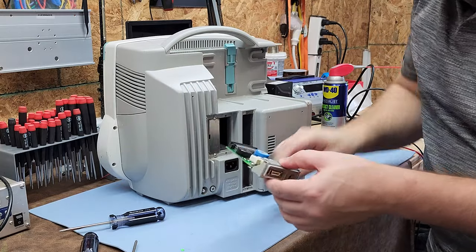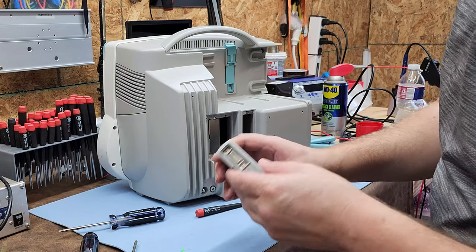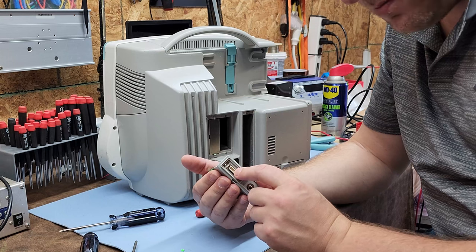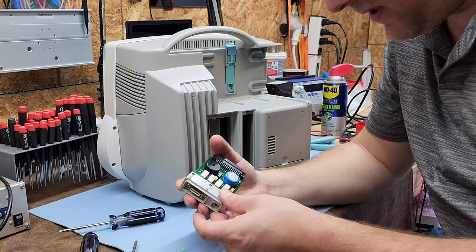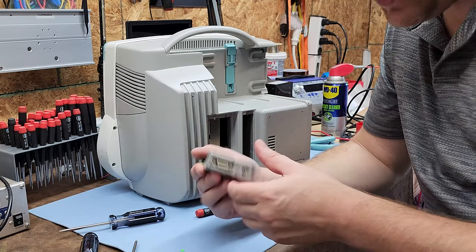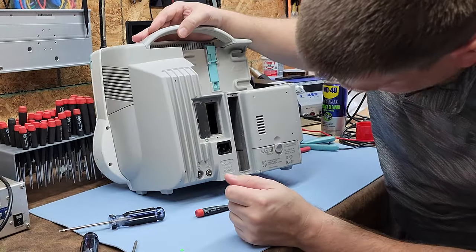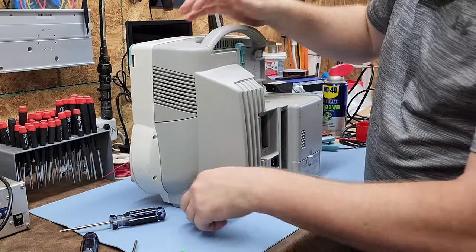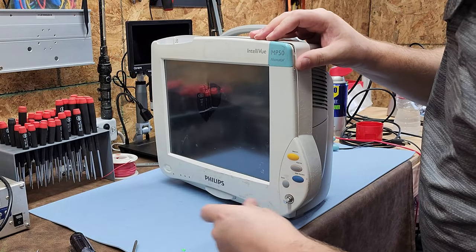Here we go — this is an alarm interface card. This connects to your nurse call system. The dead giveaway is it's got the alarm connections on it — so this is an alarm expansion module that connects to your nurse call system. I had it wrong earlier, but it's been a long time since I've dealt with these.